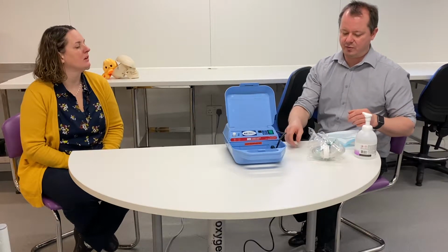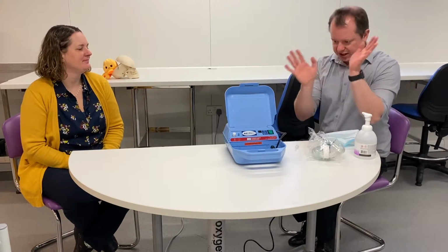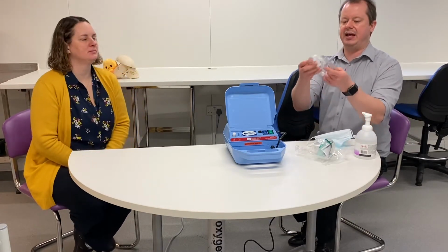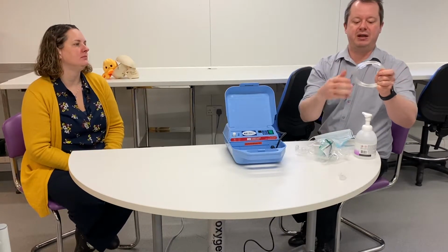So if we're happy, we've got our patient, we've identified them correctly, we've introduced ourselves, we've checked the prescription, we've checked the drug, we can then start to construct our equipment. So we are going to collect a nebulizer mask and equipment. They come in one big pack.